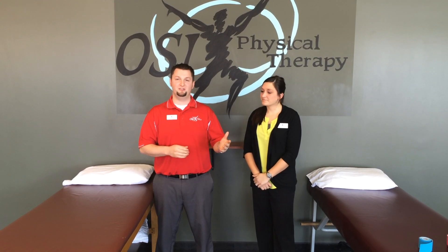Good afternoon, welcome back to OSI Physical Therapy at our West St. Paul Clinic. I'm John. Hey guys, I'm Trisha. Trisha and I today are going to go over what we might do in the clinic using Kinesio Tape for kneecap stability and pain control.